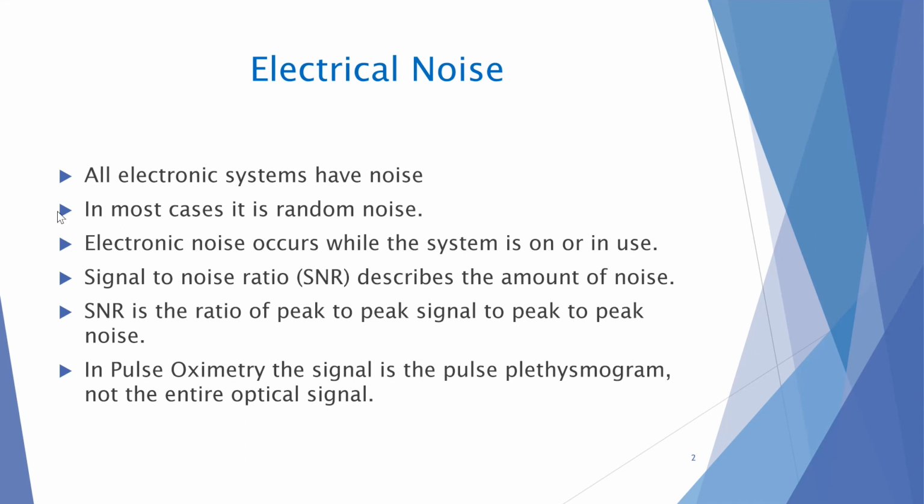Dr. Feiner can maybe. Yeah, well, I think the other notable thing to pay attention to is the increased noise with dark skinned subjects too. It's not just the bias that changes at low perfusion and low sat, but the variability in noise, which I think is bigger for dark skinned subjects.